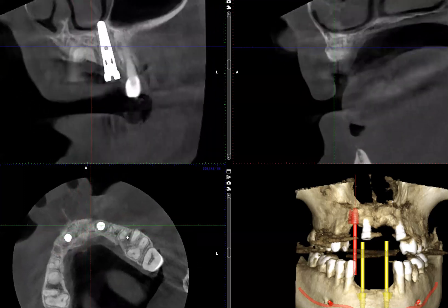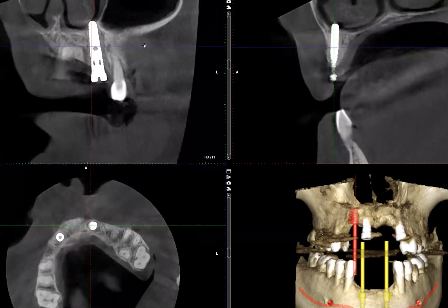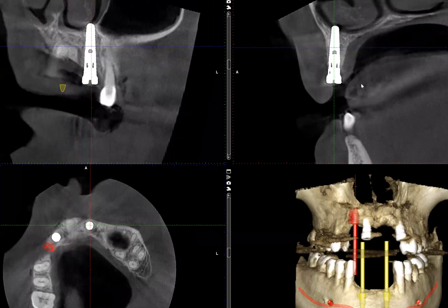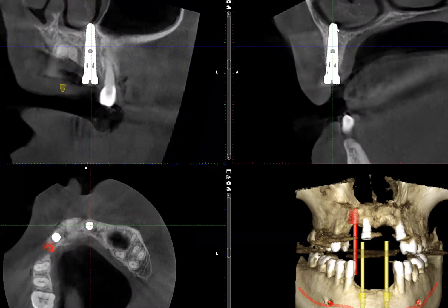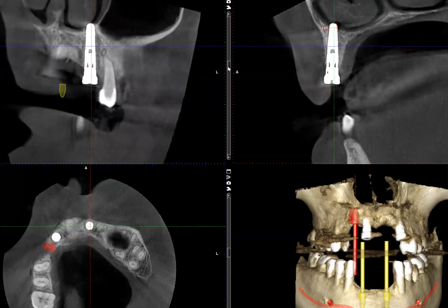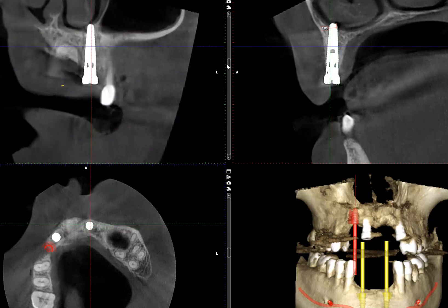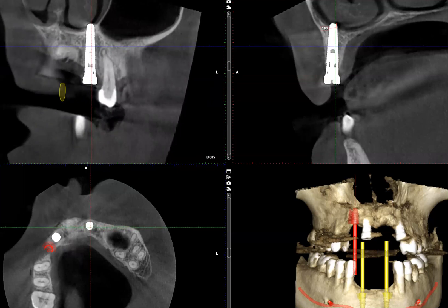If we rotate the volume to look at implant number 11, starting with the sagittal view, it is again extended beyond the floor of the nasal cavity. Measuring this, I'm getting 1.8 millimeters. Looking at this again in the coronal view, we see that it has extended not only above the floor of the nasal cavity, but now it's abutting the patient's left inferior turbinate. Similar to what we saw on the other side, I do not see any overt sign of inflammatory change of the mucosal layers along the floor of the nasal cavity.